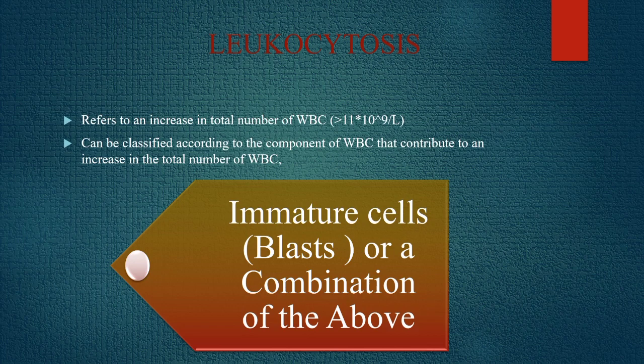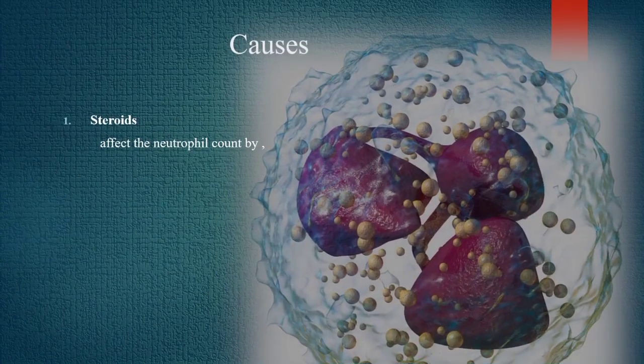Let's discuss some causes of this leukocytosis. There are many factors at play. Sometimes we misinterpret this and we think it's just an infection, but there are several factors. Let's start with steroids. Now, steroids mainly affect the neutrophils.